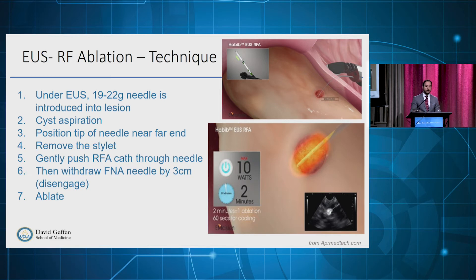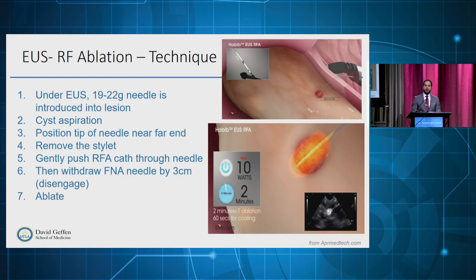The technique steps are: we start with EOS guidance, insert a 19 or 22-gauge needle to the targeted lesion, aspirate the cyst first if applicable, and position the tip of the needle at the far end of the lesion. The stylet is removed, the RFA catheter is gently pushed through the needle, and we withdraw the needle slightly — called disengagement — while maintaining the RFA probe within the lesion, then start ablation.